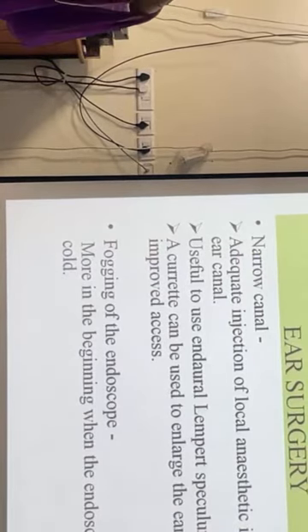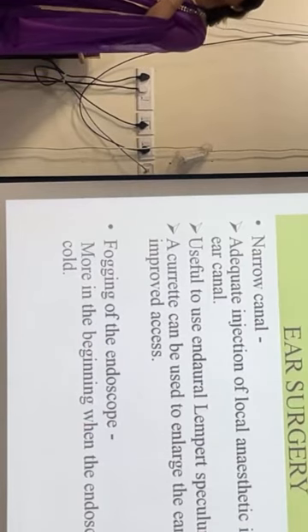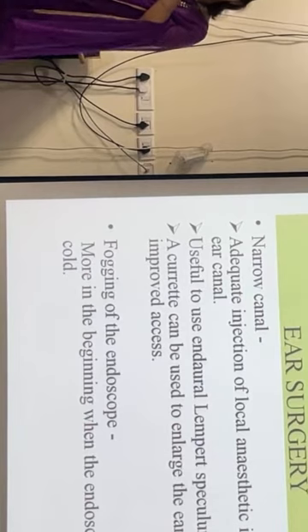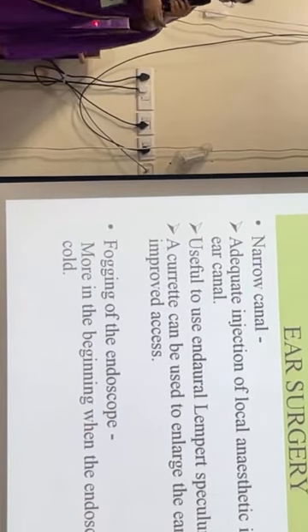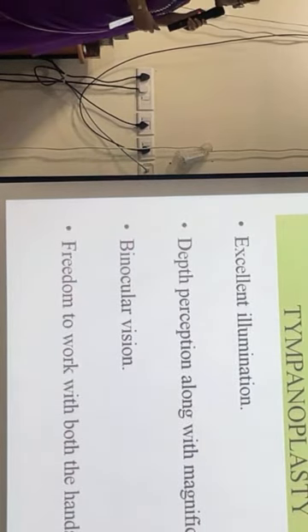So when we start a case, because the scope is cold and there is a lot of moisture in the ear canal, initial fogging may be more, but as the surgery progresses, the frequency of fogging decreases.